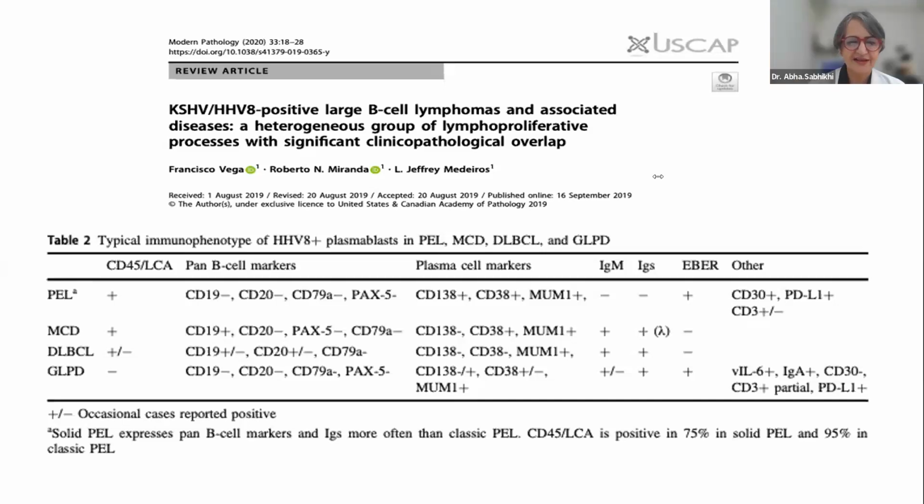Right. Should we move on to the last case? Absolutely, ma'am. We have so many interesting cases that we've got lost in them. I know we have two more cases actually. We'll just ask the presenters to be a little careful about the timings. Our next case is Dr. Pooja, from Dr. Fatke's lab, and she will be presenting a very interesting case of a 43-year-old female patient with an axillary lymph node biopsy, clinically suspected to be tuberculosis or lymphoma. Dr. Pooja, over to you.